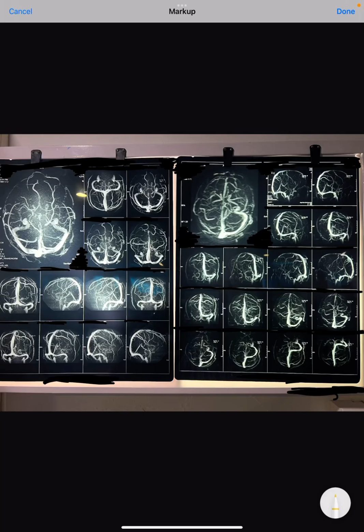Today we'll be discussing the venogram. A venogram is purely done to see whether there is any venous sinus thrombosis or cortical venous sinus thrombosis. Most of the time, patients present with a definite history of headache, which is extremely common, usually followed by convulsions or altered mental status.